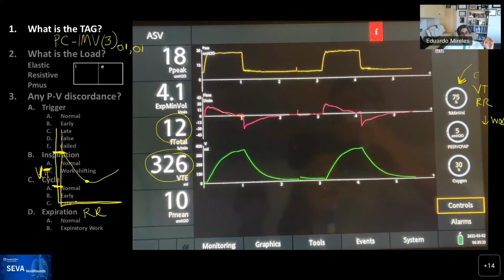And then they also have the ability to measure the time constant, and they will say, we don't want to generate auto PEEP on this patient, and you can generate then a graph, a square that we call, in which if you stay within, you're not going to have auto PEEP or very short inflation time that could be deleterious to gas exchange, and you will not have very low or very large tidal volumes. And that's the intelligent part of this mode, essentially calculating and adjusting by measuring continuously the time constant, as well as measuring the work of breathing for that size of patient.